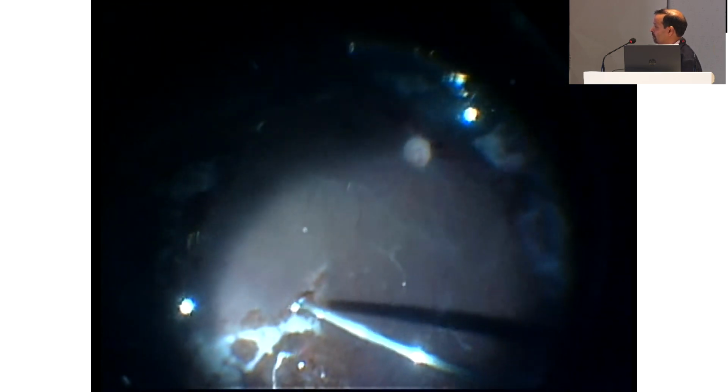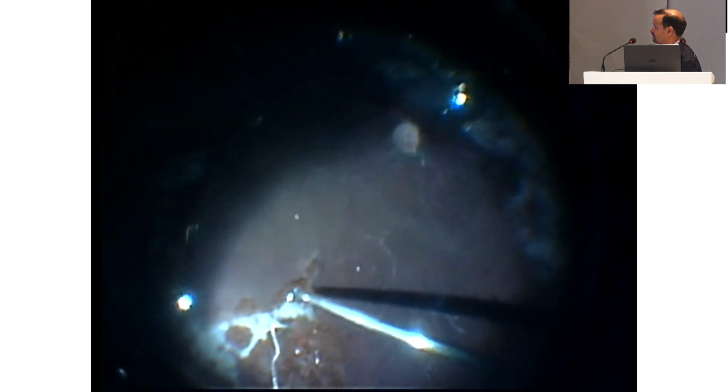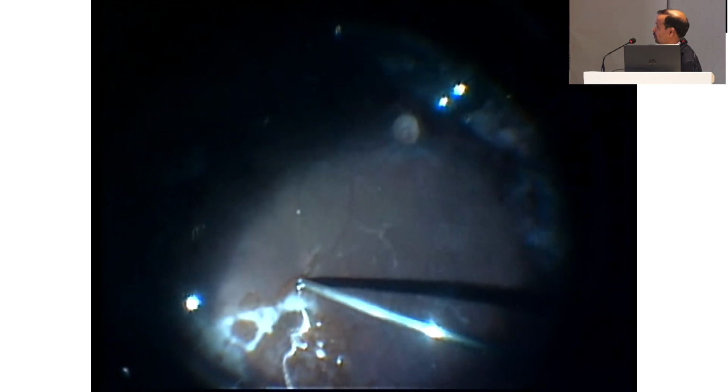need to apply wide laser, 4 to 5 layers, all along 360 degrees. Again, this is not a choice here. You need to laser in 360 degrees. You can see here I am giving 4 to 5 rows of laser, and that would be continued all around.